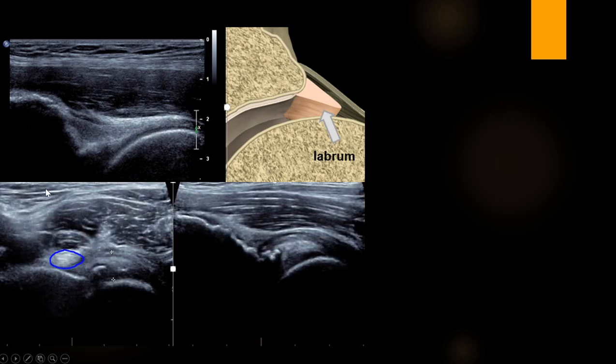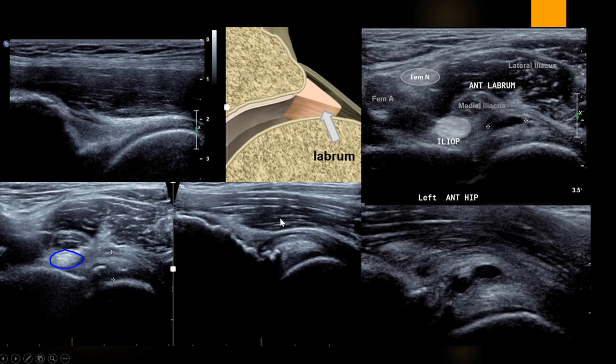In transverse, we shouldn't see this sort of a bulge. So this is the iliopectineal eminence here meeting the femoral head. So we're in transverse at this same level. We should see femoral artery, psoas muscle, and nice neat iliopsoas tendon. But here we can see that there's some capsular thickening, some degenerative change around the area of the labrum, and these little anterior acetabular rim osteophytes. So these are quite common. And you can see how this bowing up of the capsule could cause some irritation to the tendon and even cause the tendon to flick.